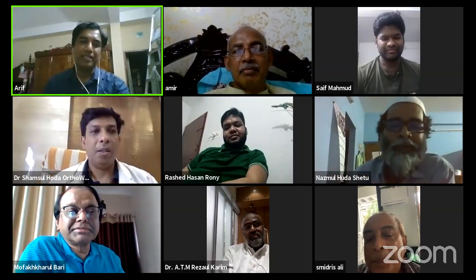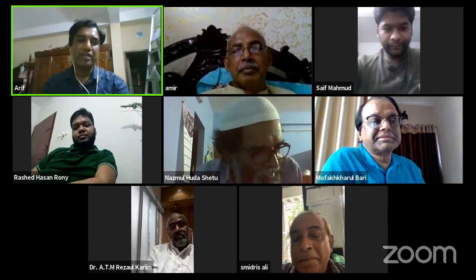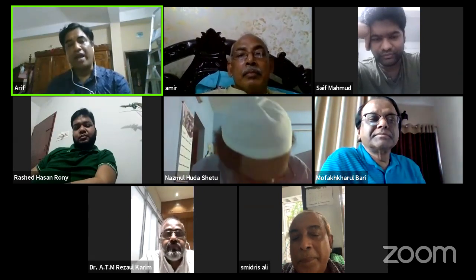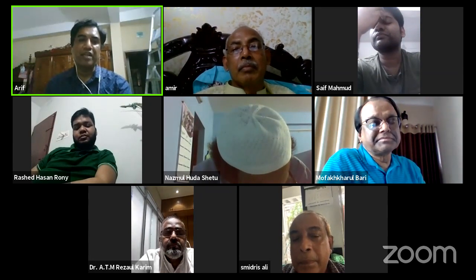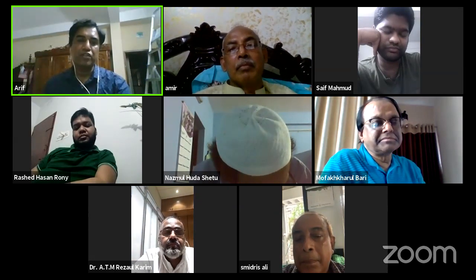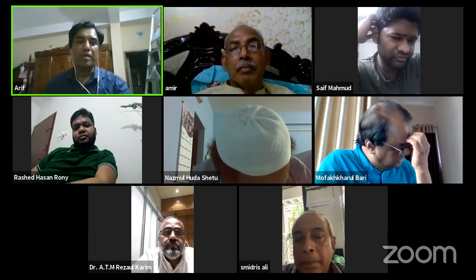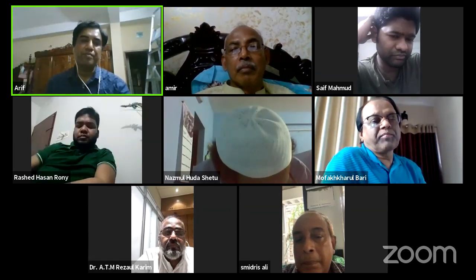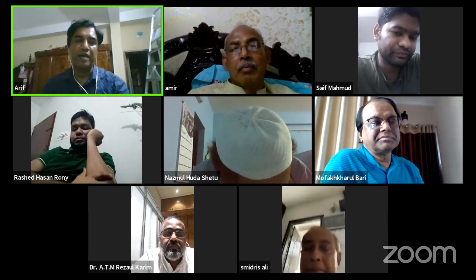Sir, I got your question, and this is a very burning issue for the Ilizarov surgeon, because you distract the bones for a very long time, but at the docking site there is non-union, and also interposition of the muscles and the skin sometimes between the fragments. So how can we prevent this type of problem? Nowadays newer techniques and principles are coming on how to deal with a long gap, like when the gap is more than 5 or 8 centimeter. Usually, to shorten the time of external fixator and the time of distraction, many people, even at the Kurgan center, nowadays practice multifocal bone transport. If you do multifocal bone transport, you can shorten the distraction time, and the viable ends of the bones come into contact very easily in a short duration of time. But think about that, after all of these precautions, the soft tissue is interposed.